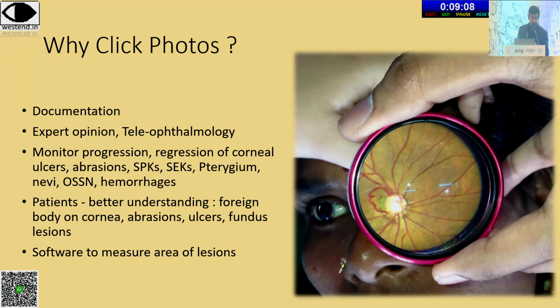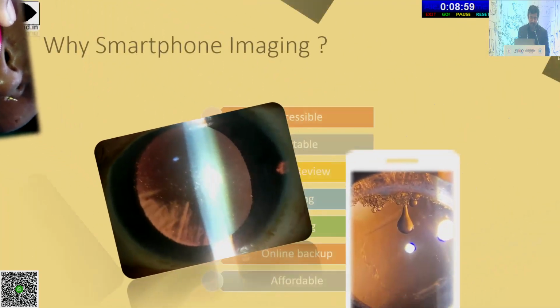And you can also use software to measure these lesions. It is not very difficult. I'll show you how you can use a software on the phone, an app, to measure these things.